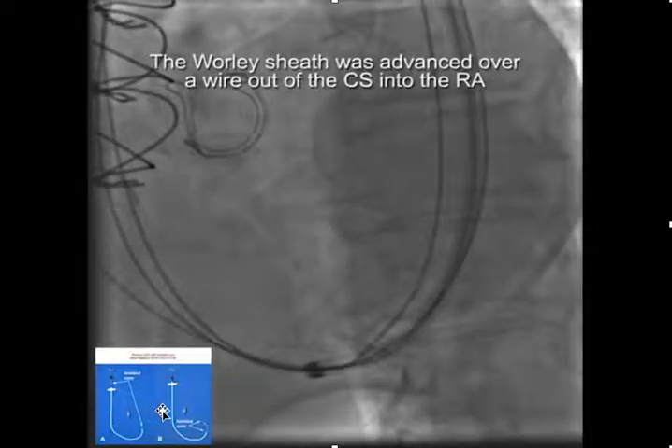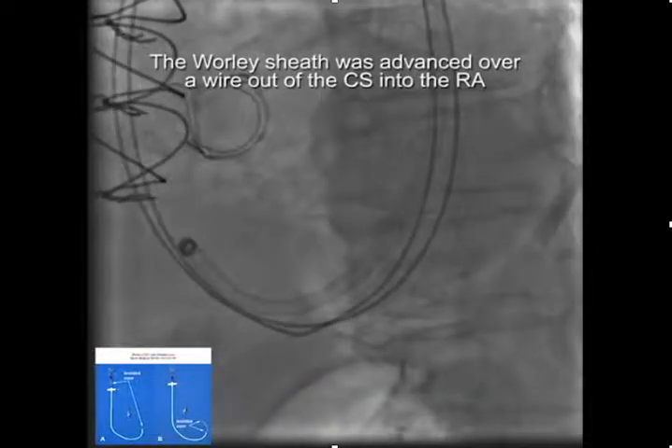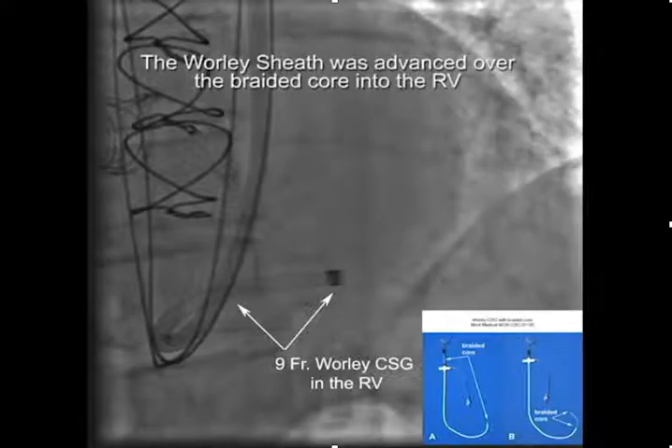We started off and placed the Worley sheath in over a wire — that's the nine French internal diameter peel-away sheath. We then used the braided core to torque into the right ventricle. Here's the braided core and the sheath itself, and once the braided core was in place we were able to advance the sheath over it. Now we have the nine French sheath in the right ventricle.